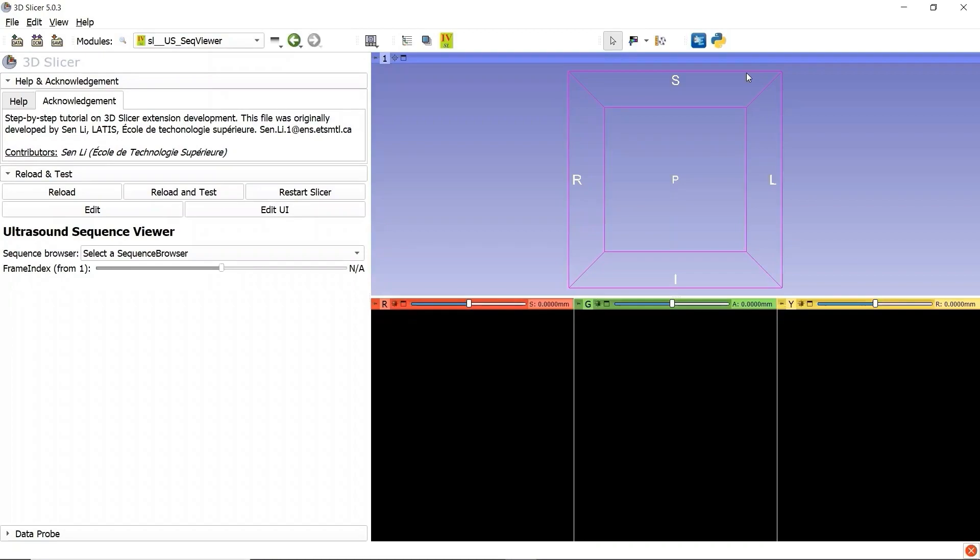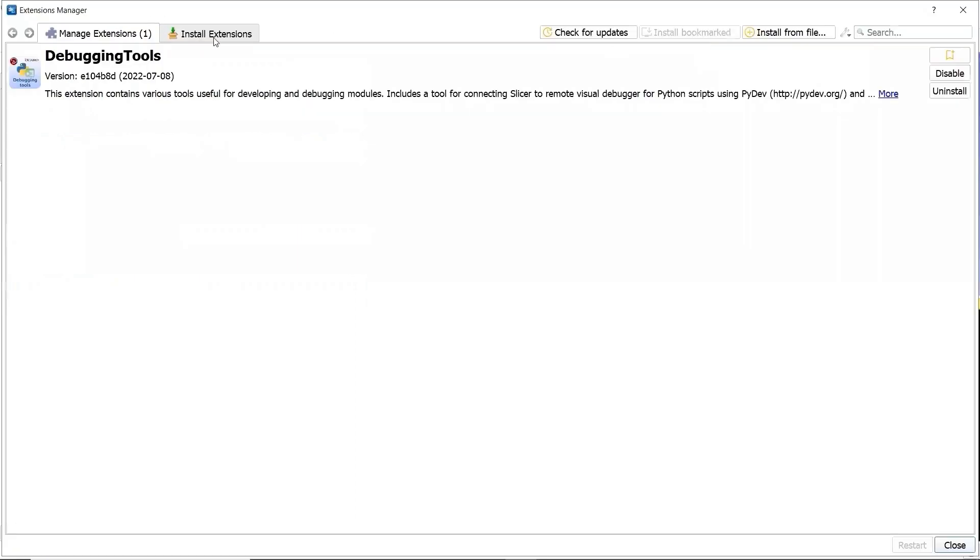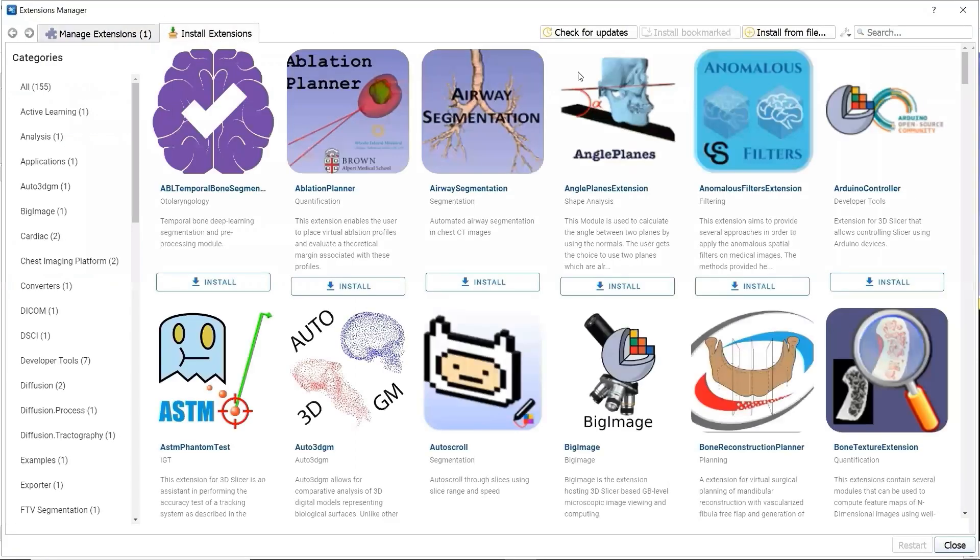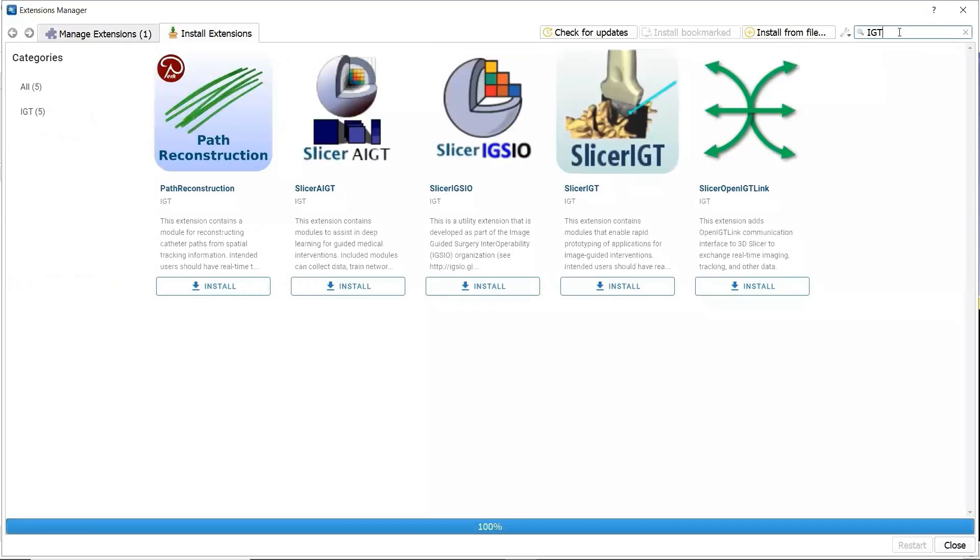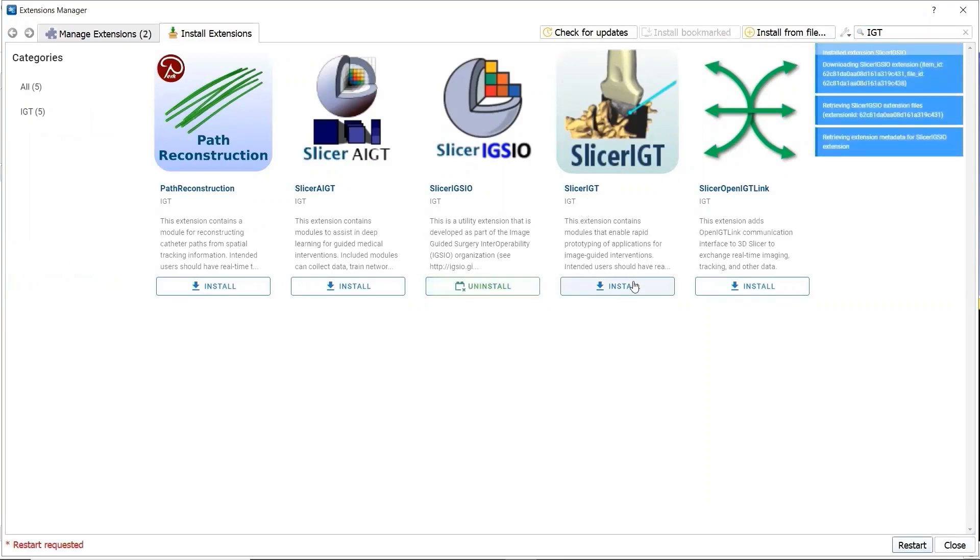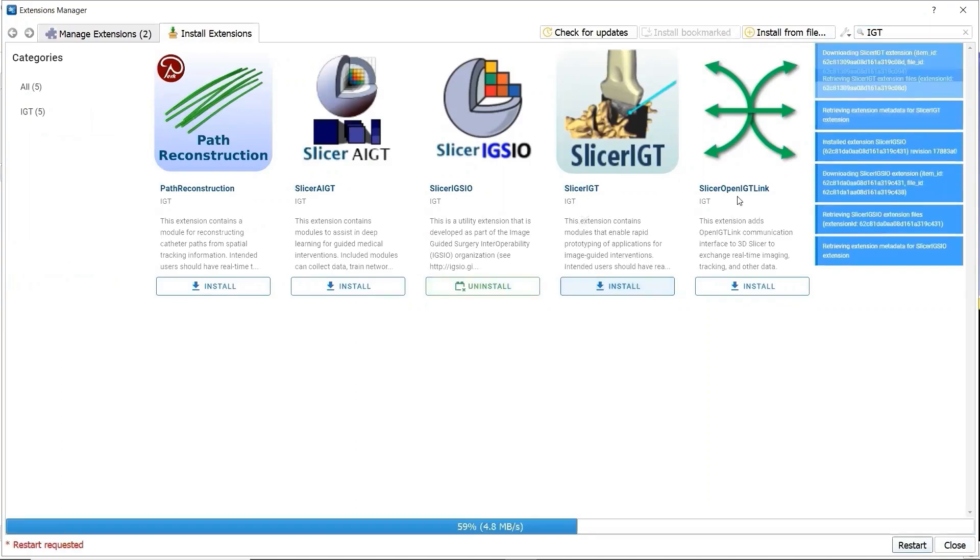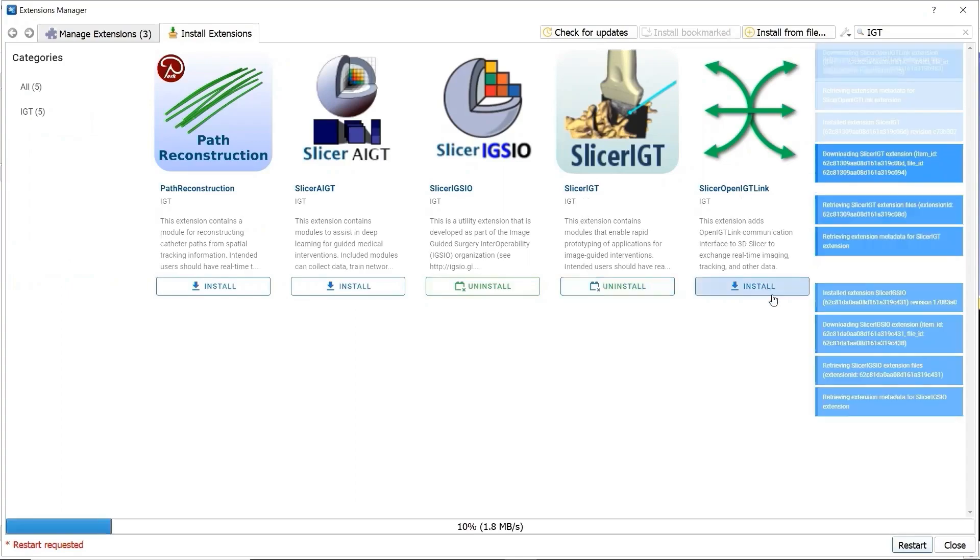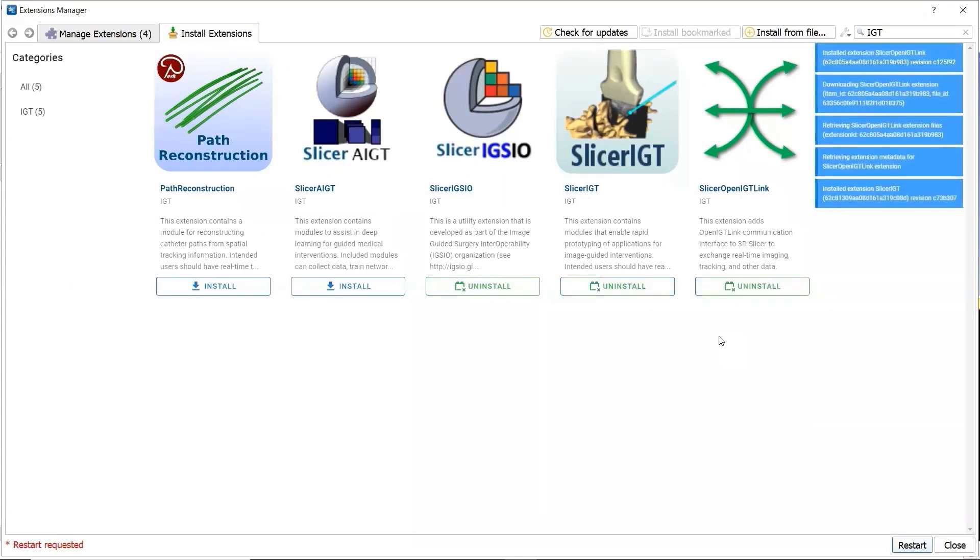In order to correctly load the ultrasound sequence files, we first need to install 3 Slicer Extensions about image guidance. Let's go to the Extensions Manager. In the tab Install Extensions, we search for the keyword IGT. The extension Slicer IGSIO, Slicer IGT, Slicer IGT link are the 3 extensions we have to install.